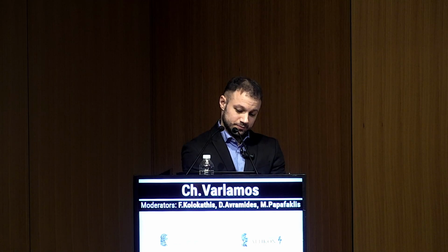And so I just wonder that simplification may come in time, that if you, on imaging, you can almost certainly get away with ballooning. You get a great balloon result, maybe you use some cutting or a scoring balloon, get a fantastic balloon result, DCB, and then you could even do a CT and check it all looks great at 6 months. So I think there are changes for me, or you just stent back to left main, which is certainly my way of doing things now, because I've done this too many times, and I think you have the worst of all worlds, because if you've got to get back into that circ now, it's going to be a disaster. That's your problem. Okay.